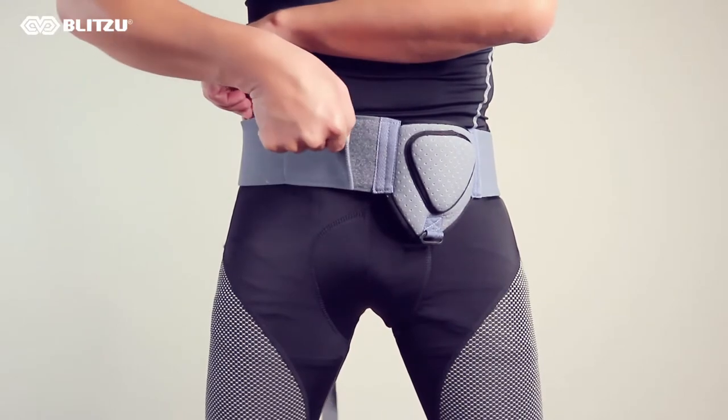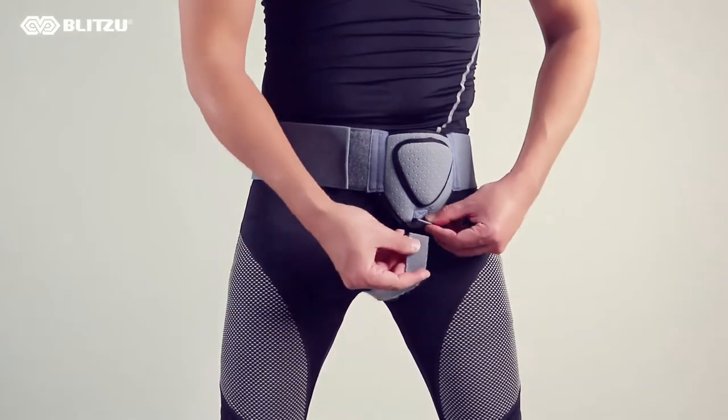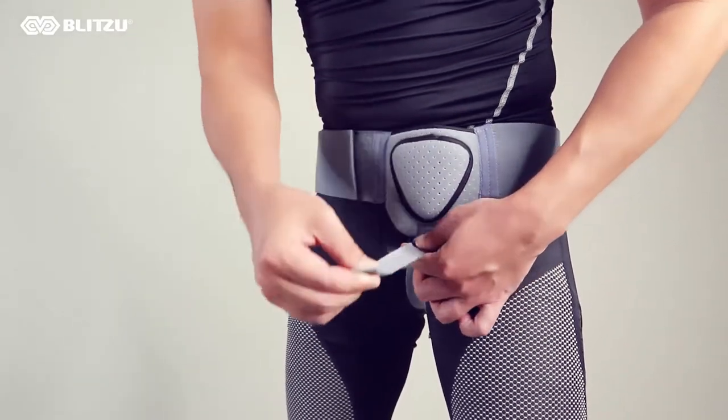Overlap the belt, then fasten it with Velcro. Reach through and adjust the tension strap between your legs to the desired pressure level and attach the fastener.